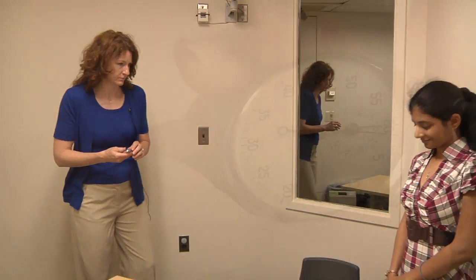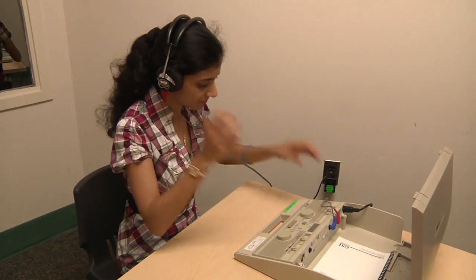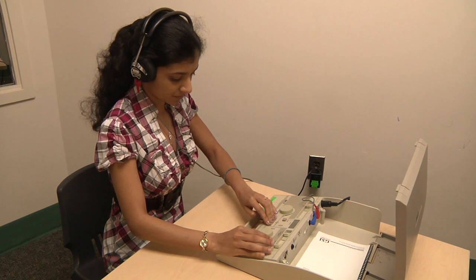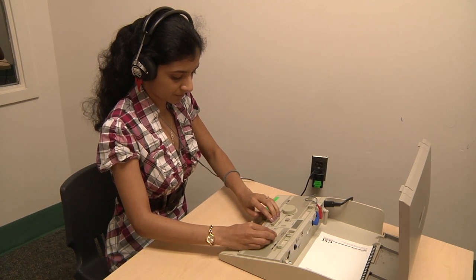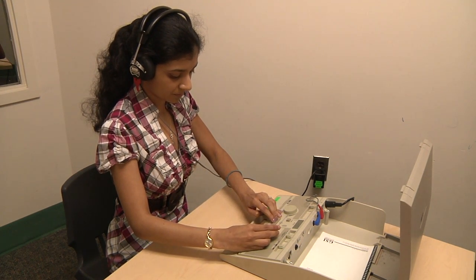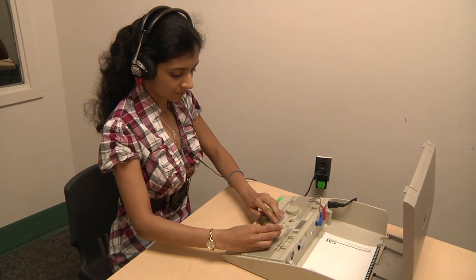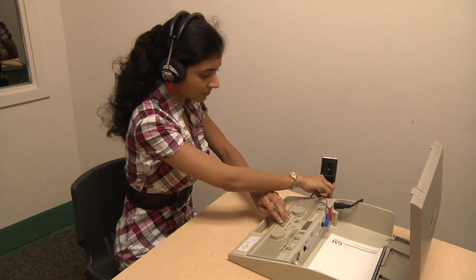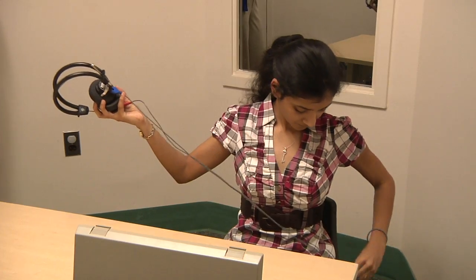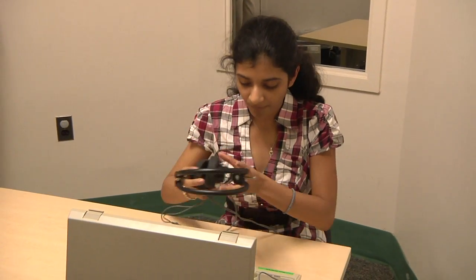I'm going to ask Sangmitra to go ahead and do a listening check, and I'm going to time her while she does it. Done. 43 seconds. Start to finish, less than a minute. It's well worth the time.